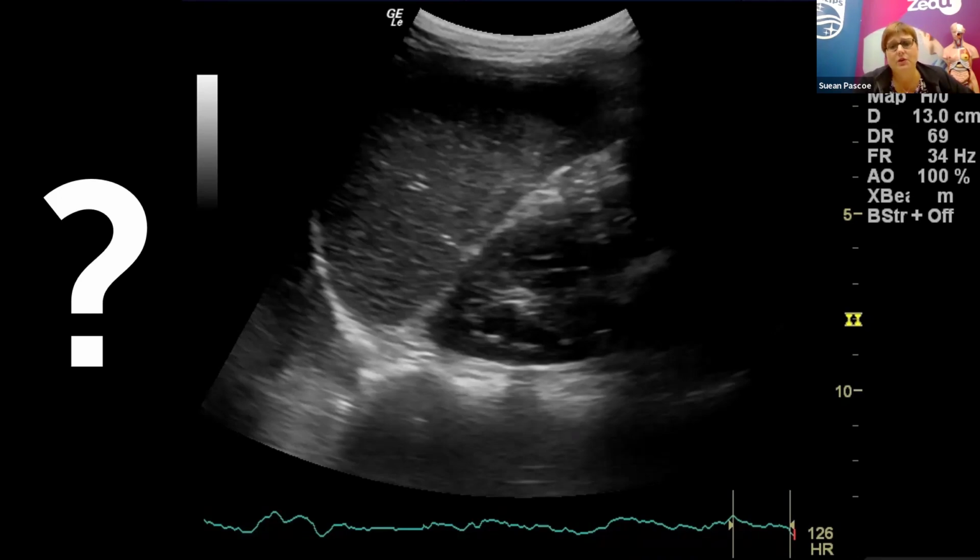So by asking those questions, I can determine, is the examination appropriate? Is the exam within scope? Are they actually asking the right questions that can be answered with the point of care exam? And are those questions ones that have a yes or no answer?